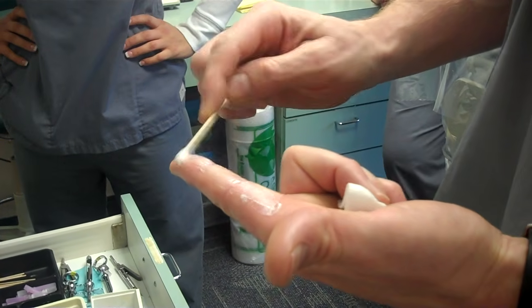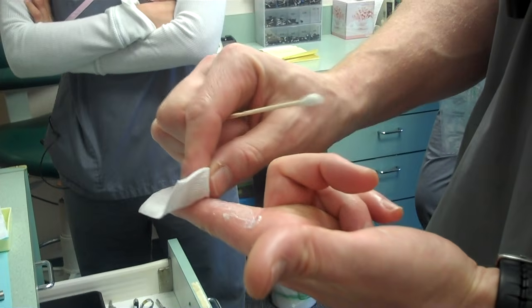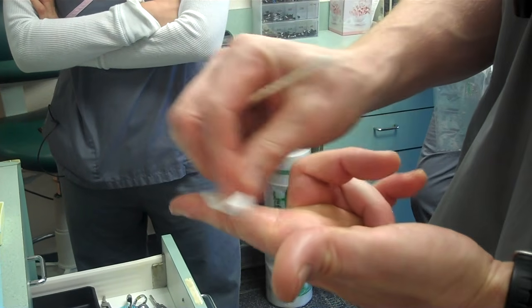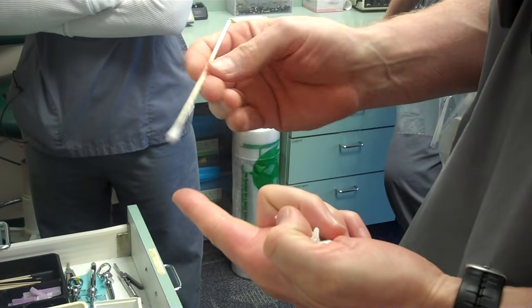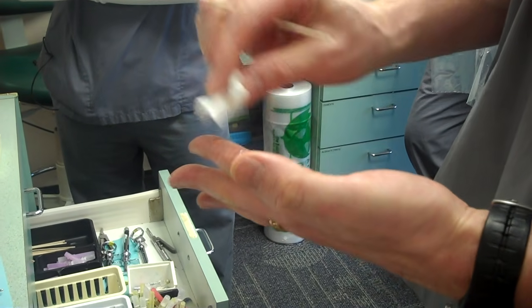If you slather it all over the mouth and don't cover it up and they take a nice swallow, this will be washed with saliva down their throat, and because this is such a potent topical, the patient's going to think that they're choking, and they'll sit there for the next 30 minutes choking in your chair. So if you're going to use the topical, and you should use the topical, remember just one spot is where we're going to put it, and that's it.